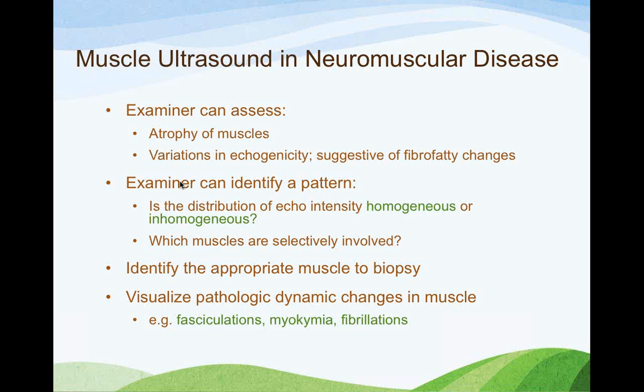Now you can also pick these up on EMG when you stick the needle in the muscle. These also have characteristic action potential appearances on a screen, but you can imagine that oftentimes these changes are also patchy, and you might stick your needle in one area that's not affected. Additionally, with the ultrasound, you can actually see the breadth of how far these changes exist, meaning how many different muscles it is actually affecting, and actually visualize it. So that's an added benefit to the muscle ultrasound.